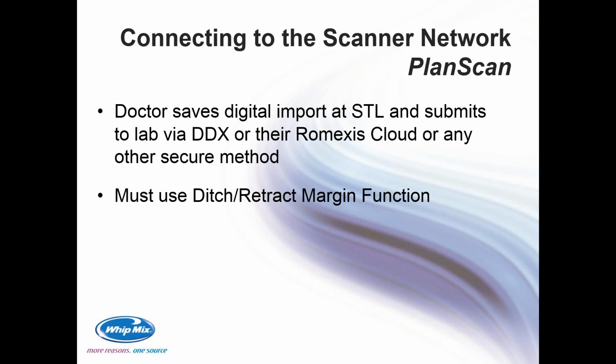I've had this conversation with a couple different labs I work with that they've told me when they started receiving files from the PlanScan, there were no margins marked, and they weren't able to mark the margins. And there was quite a bit of back and forth between the lab and the clinic on the doc's side to figure out where it was. And it's on the clinic side, and it's whoever is saving the STL, preparing it to be exported, they must use the ditch retract. So if you get into a point where you're starting to receive files from the PlanScan and you don't have any margins, it goes back to how that file was saved.